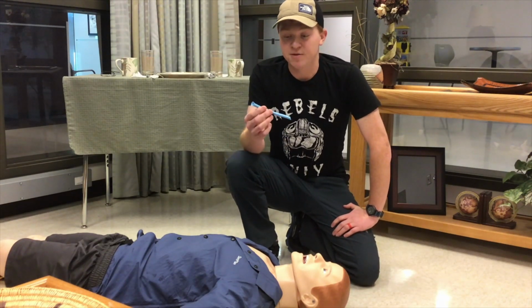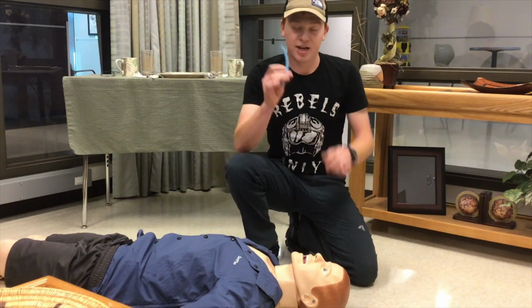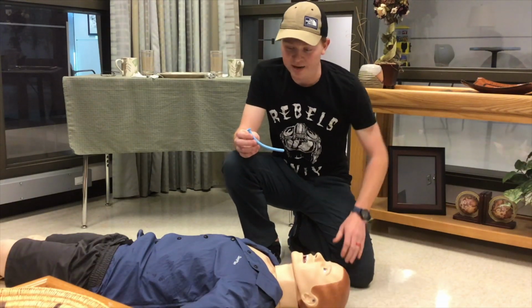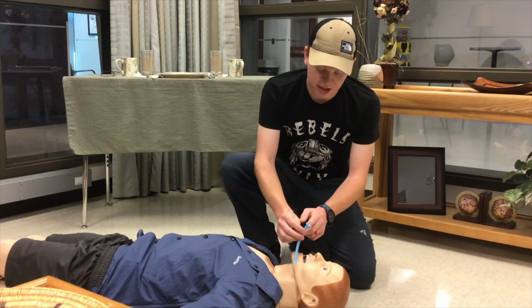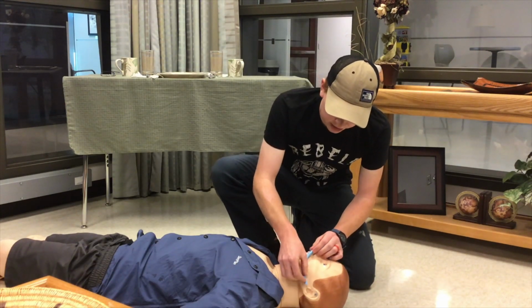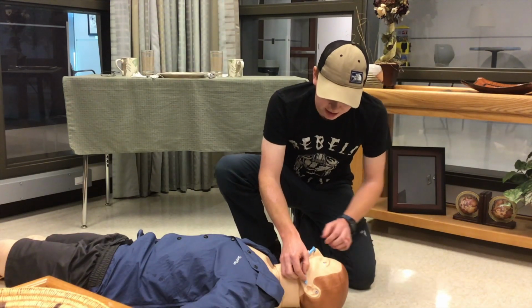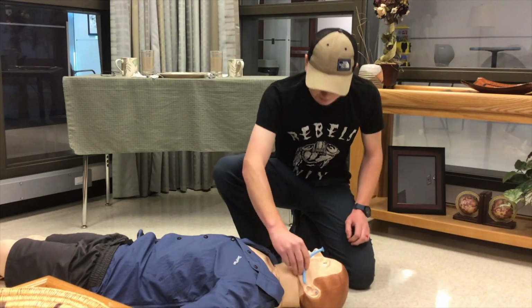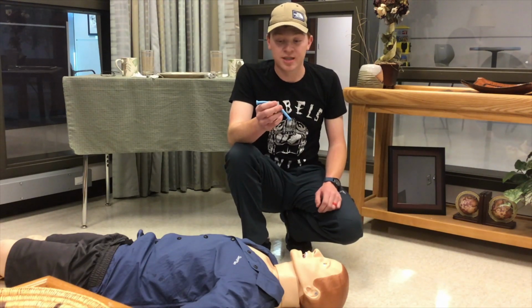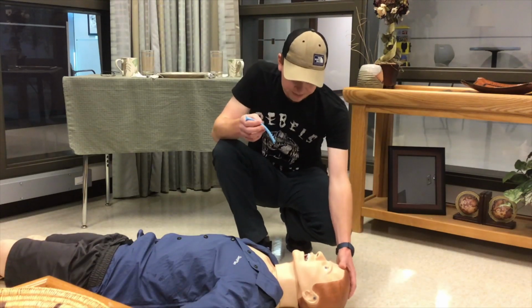So first off, there's a couple different sizes of NPAs, just varying in size. I've already got the proper size out for this mannequin. All right, so we're going to go over sizing of the NPA on the patient. You're going to take the flange end that comes out like a funnel, and you're going to put it by the tip of the patient's nose, and then you're going to measure the beveled end, the part that's going to be going in the patient, to the patient's earlobe. So this is appropriately sized right here. And then you would go ahead and lube up the NPA. For today's demonstration, as it is on a mannequin, we won't be doing that for sanitary purposes.